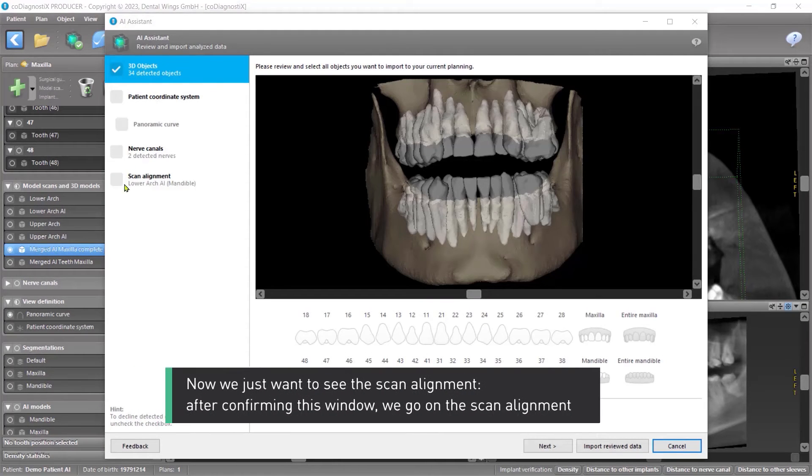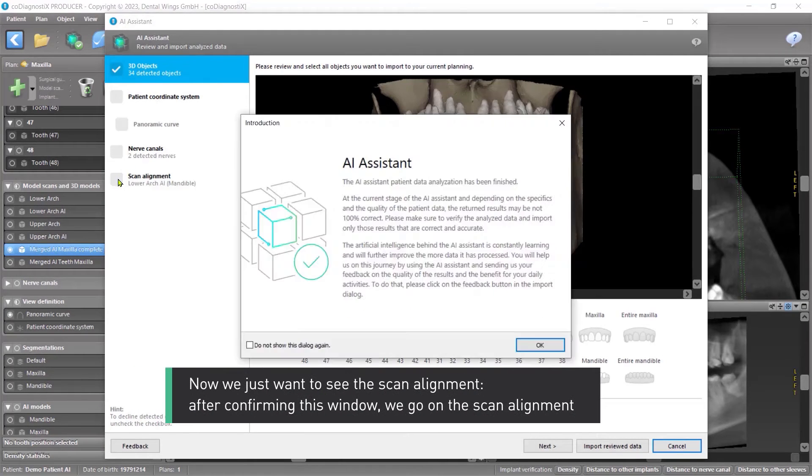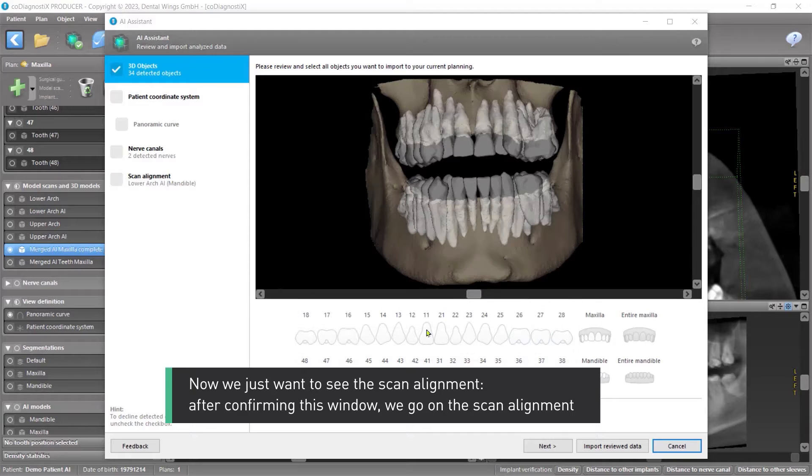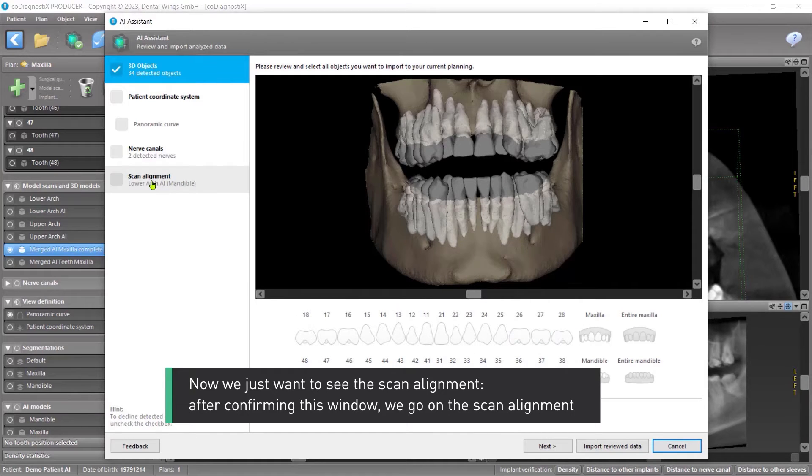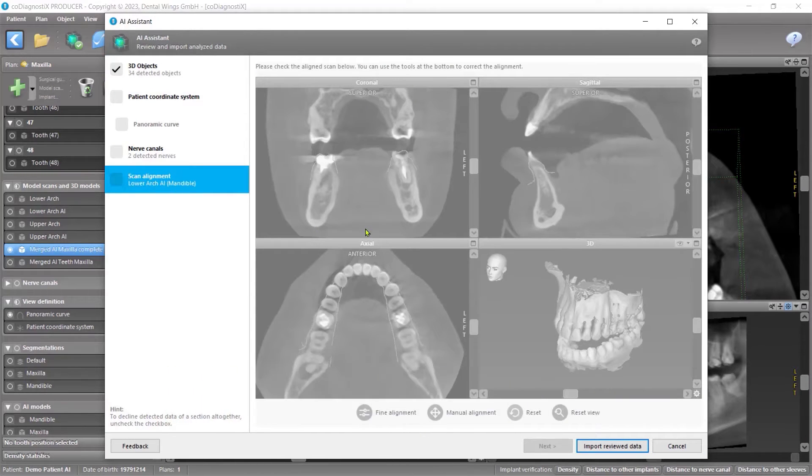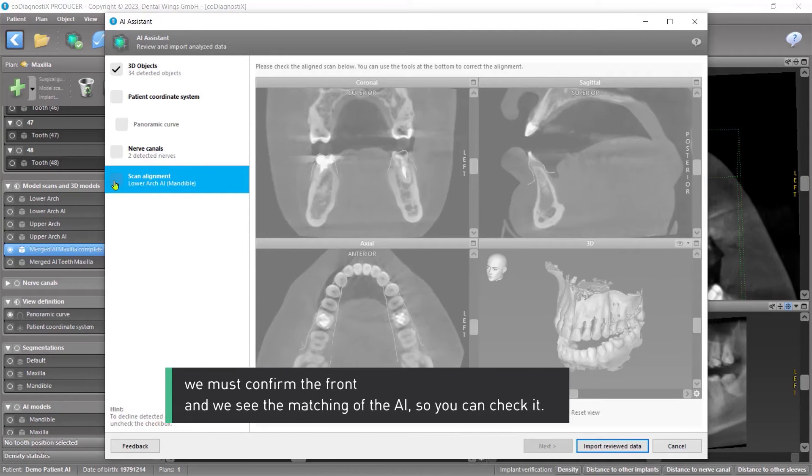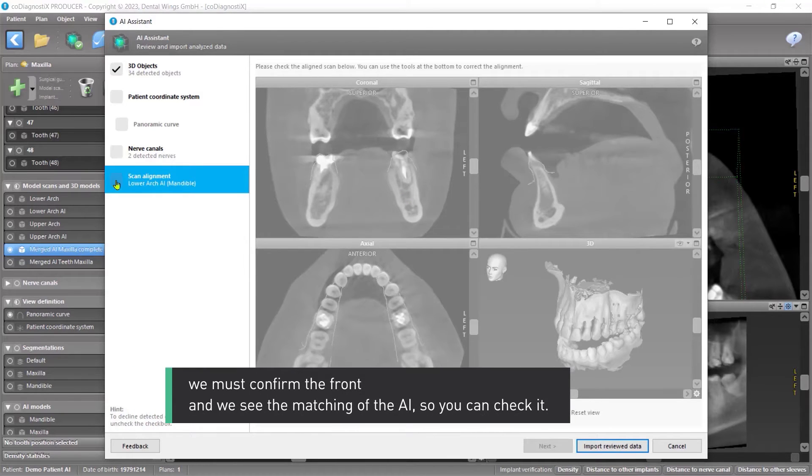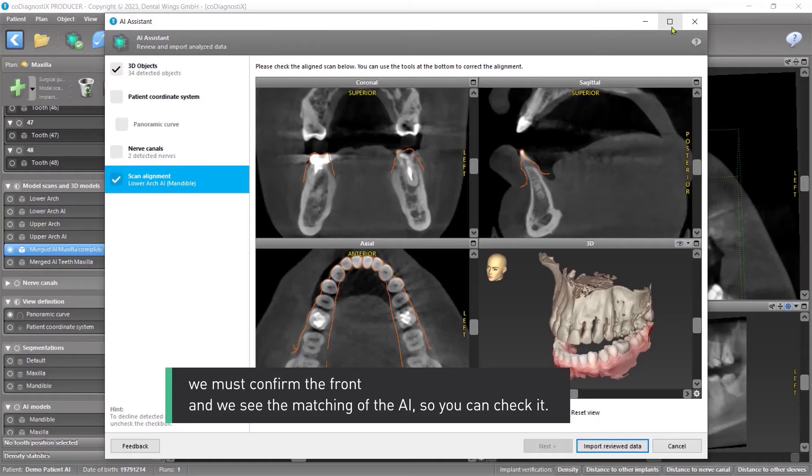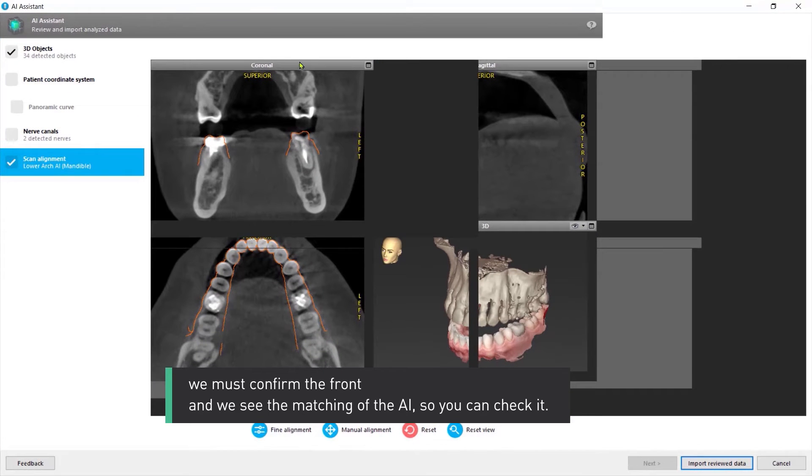Now, we just want to see the scan alignment. After confirming this window, we go on the scan alignment. We must confirm the front. And we see the matching of the AI, so you can check it.